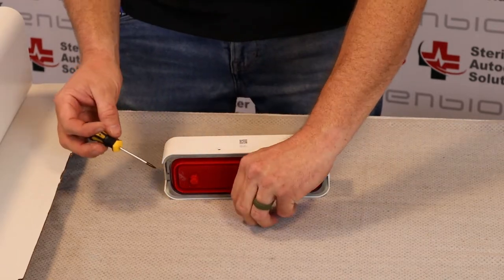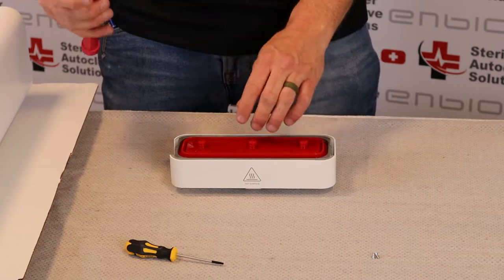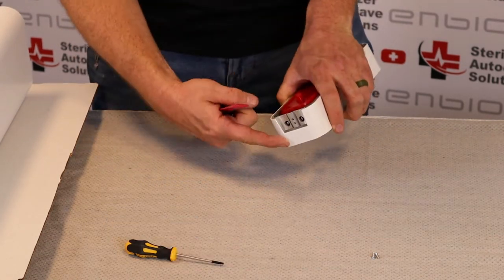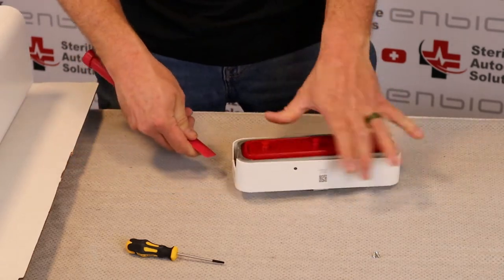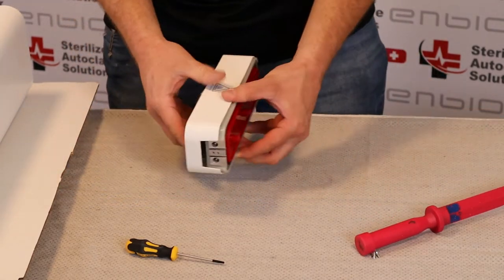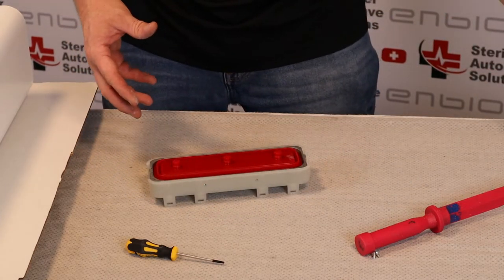We're going to flip the door on its face and using a hard plastic or metal item you can insert between the white plastic and the clear plastic and pop the door out. Once that is free, you can remove the door cover and set that off to the side.